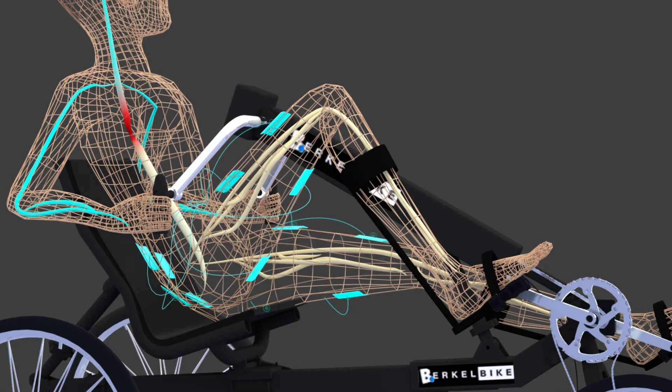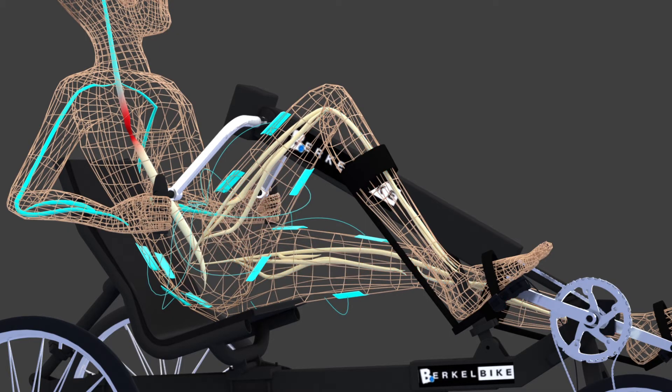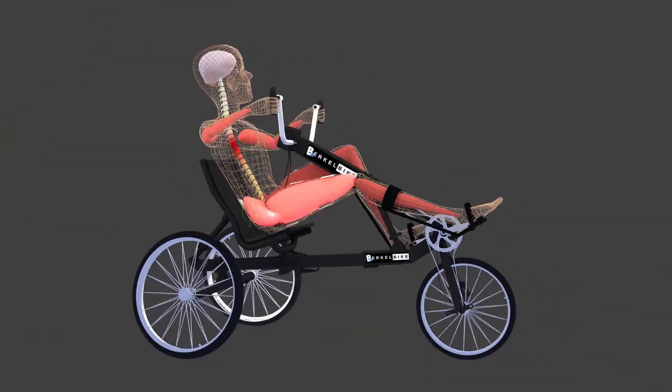This innovation makes it possible to reactivate paralysed muscles caused, for example, by a spinal cord injury. Some people with complete spinal cord injury can now cycle more than one kilometre with only the muscle strength of their own paralysed legs.